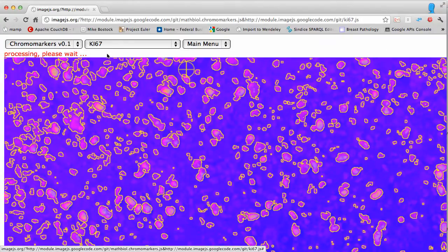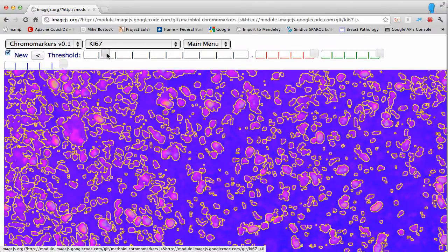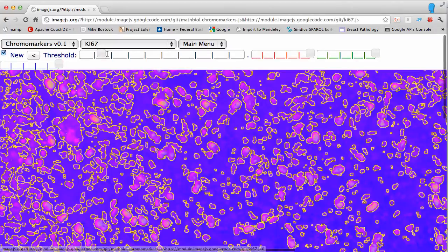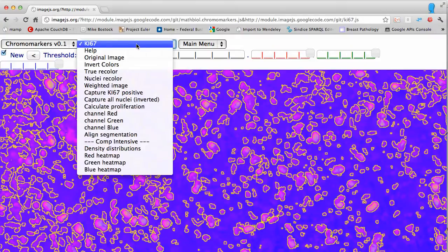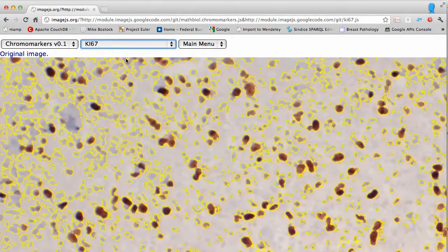This module is not supposed to automate the calculation of proliferation in ki67-stained images; it is supposed to document the way you do it so that the final value can be compared with the actual image. Like all other modules that transform an image, they are not removing the original image — they are just providing a different representation — so you can go back to the original image and find out what this segmentation represents.